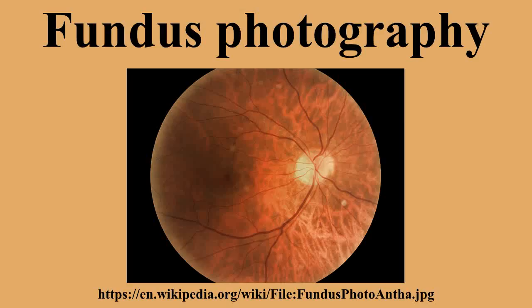The picture on the right depicts an incorrectly taken fundus photo that is out of focus and somewhat obscured. The examiner taking the fundus photo has to be extremely careful and meticulous in ensuring correct alignment, and that the picture of the fundus is in clear focus before capturing the image. Make sure the three white dots are in clear focus and aligned with the pupil before pressing the alignment button. If the fundus is out of focus, move the joystick backward and forward to focus the image appropriately. Once the image is in clear focus, the alignment process can be completed, and lastly the photo taken.